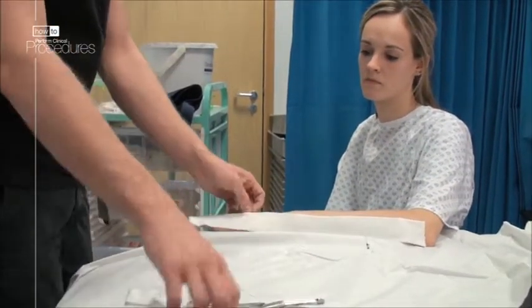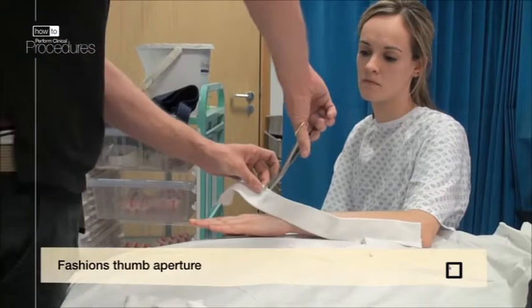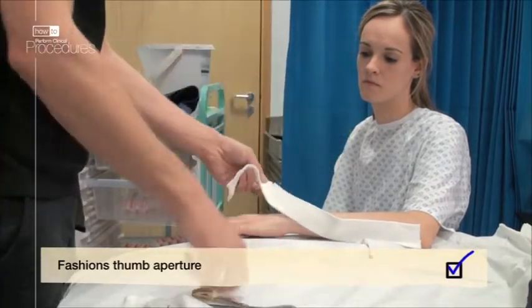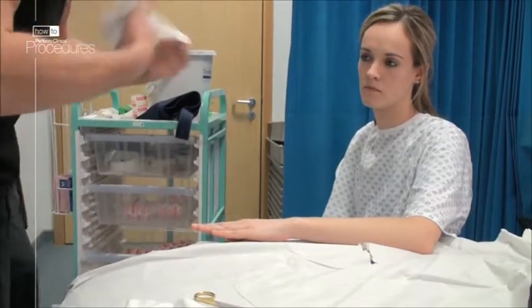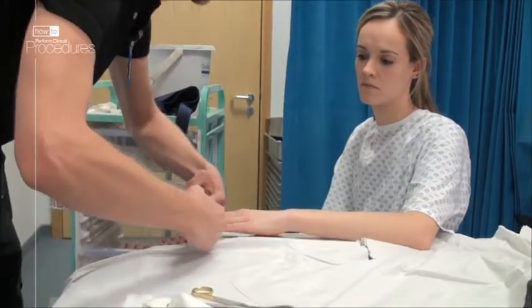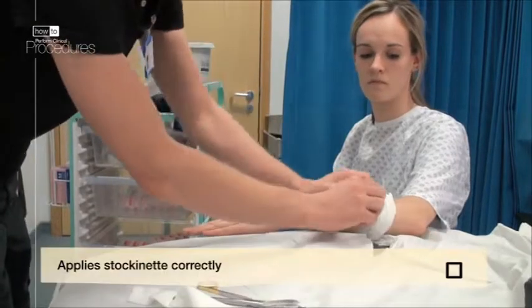Next, make a little hole at the landmark of the thumb to allow it to poke through. Cut the hole over the carpometacarpal joint, or knuckle of the thumb, perpendicular to the length of the stockinette. We are now ready to apply the stockinette.